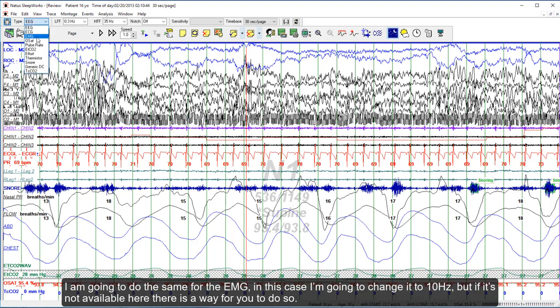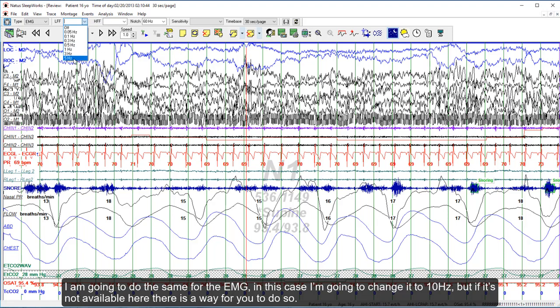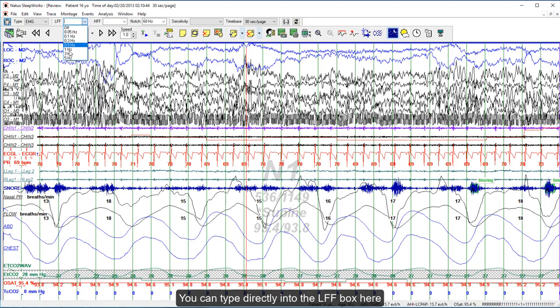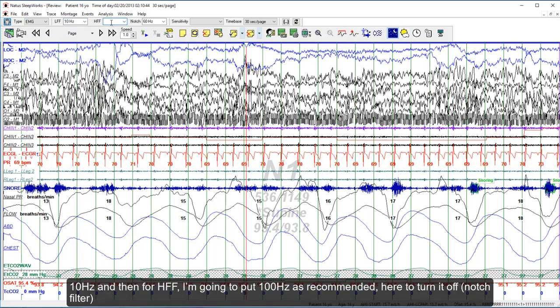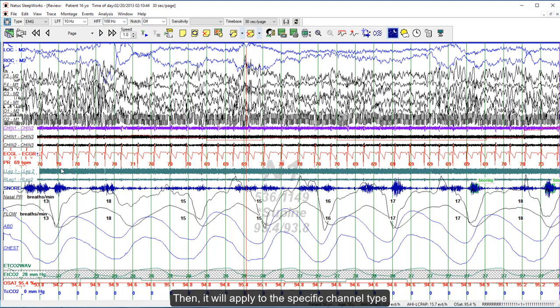I'm going to do the same for the EMG. I'm going to change the low frequency filter to 10 Hz — if it's not available in the drop-down, you can type directly into the low frequency filter box. Then for the high frequency filter, I'm going to put 100 Hz as recommended. I'll turn the notch filter off, then apply to the channel type.